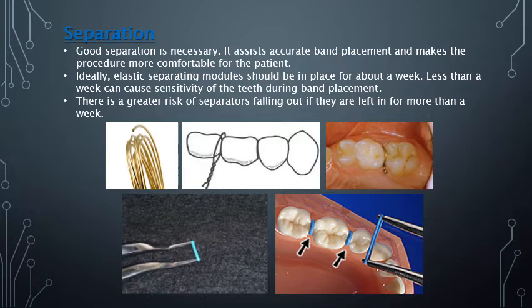Good separation is necessary. It assists accurate banding placement and makes the procedure more comfortable for the patient. Ideally, the elastic separating module should be in place for about a week. Less than a week can cause sensitivity of the teeth during band placement. There is a great risk of separators falling out if they are left in for more than a week.